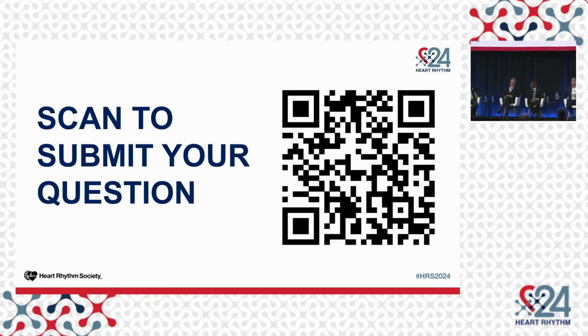Great, yeah, and I think the importance, at least in the US, is there is a firm entrenchment of loss of experience with fluoroscopy. So a lot of fellows that come out of training, when they have to do PFA and there's no mapping, they're kind of lost because they don't know how to use fluoro anymore. And the fact that the balloon can be compliant enough and you can visually see without having to step on fluoro and know you're making contact because there's no blood around, I think is really powerful, and we'll see.